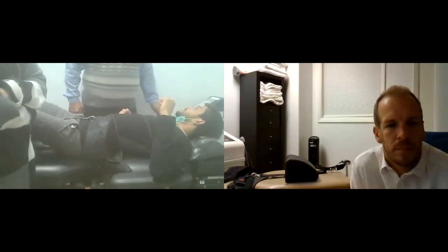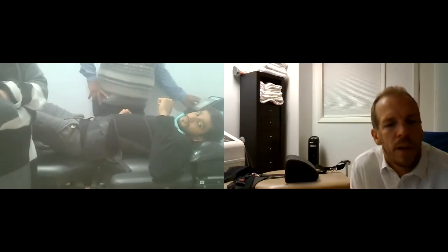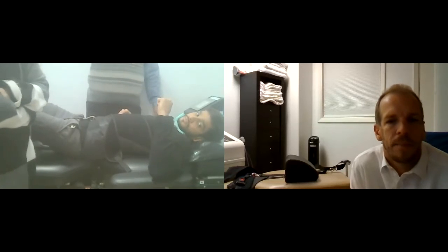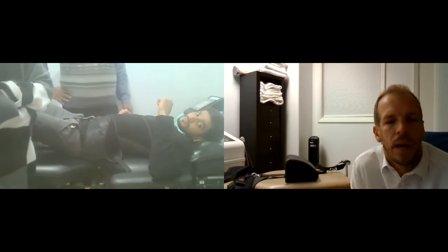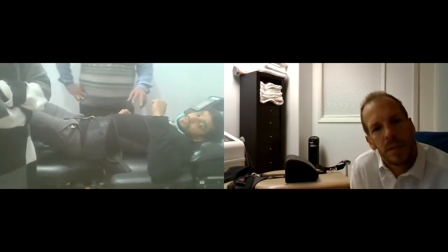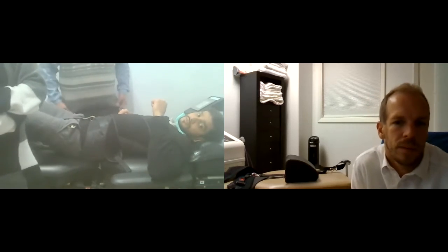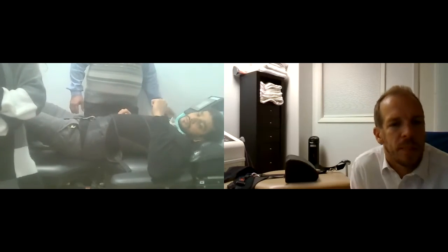He weighs 66, so 1/3 is 22. Okay, so 22 kilograms is 1/3 of his body weight.